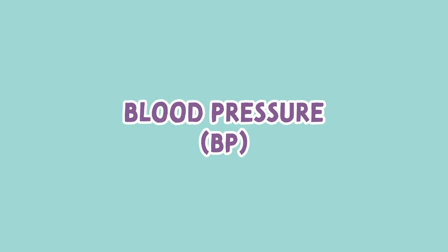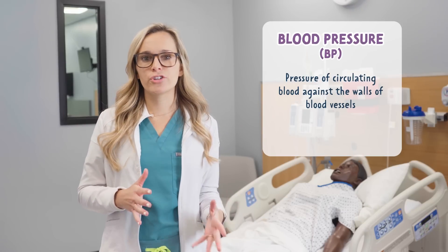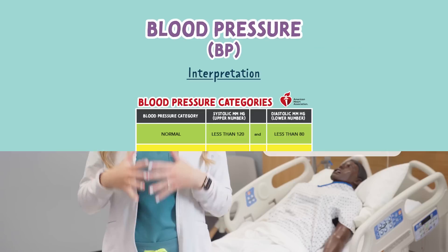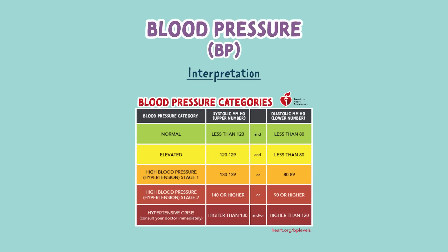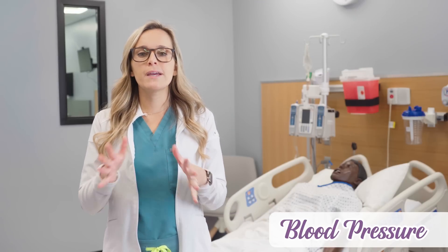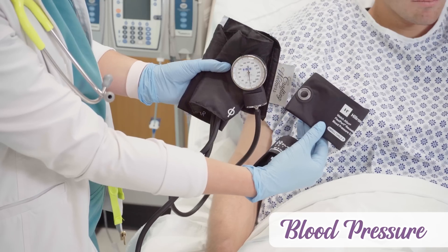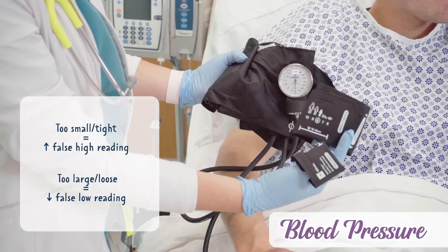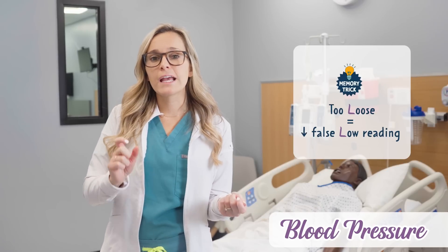Next is blood pressure. This is the pressure of circulating blood against the walls of the blood vessels, measured in millimeters of mercury, written as mmHg. This is the American Heart Association's blood pressure chart, which shows how to interpret what the readings mean. For the steps to obtain a manual blood pressure: first, make sure the patient's arm is at heart level and their legs are uncrossed. Next, choose the appropriate size cuff — if it's too small or tight, you'll get a false high reading, and if it's too large or loose, you'll get a false low reading. You can remember this with the memory trick: too loose, think false low.